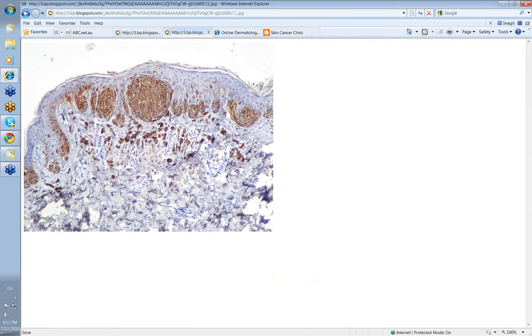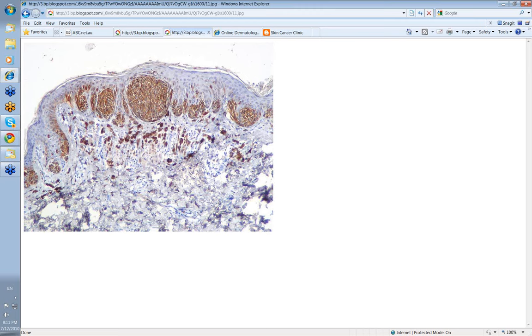Okay, so assuming this is one of the brown stains on S100, I suppose it was done here to see if some of those cells we were looking at before were in fact melanocytes. Now not very much is showing in the epidermis here. I think as David said, there was a little bit of pagetoid spread here, but the nests are quite well circumscribed here.